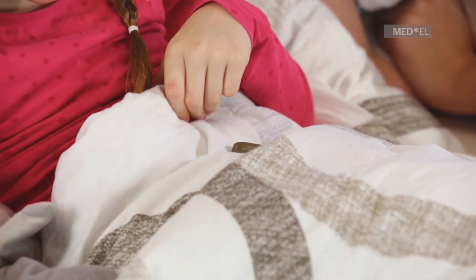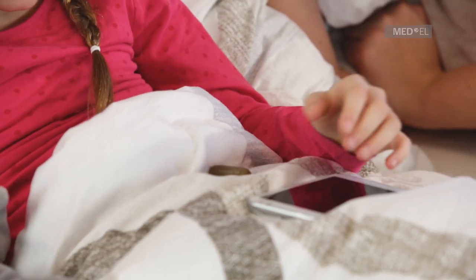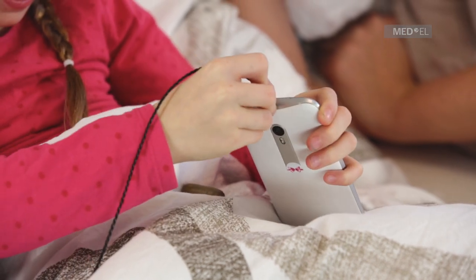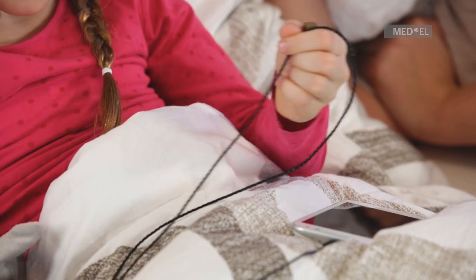Connect the cable to the external device and the audio processor. Take care that the dots on the cable and the bottom side of the audio processor align.